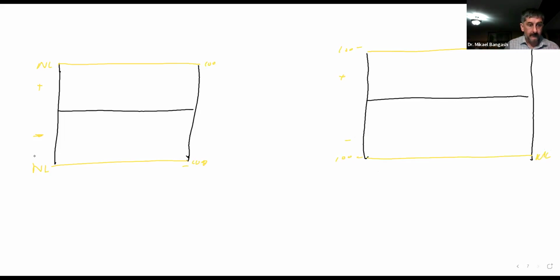Here we said, for instance, if we had a positive Doppler shift which was too high, it becomes aliasing, right?